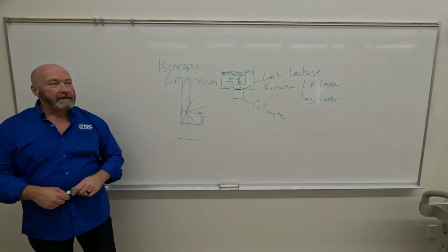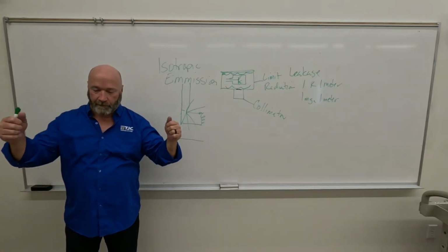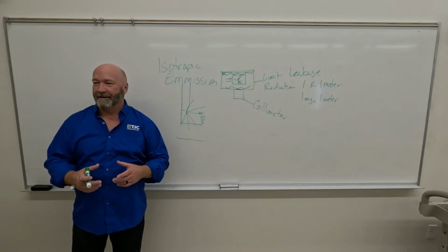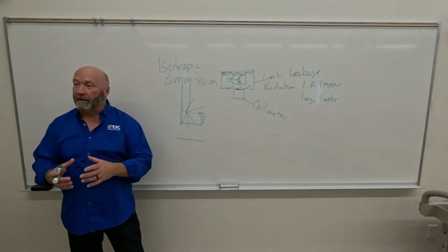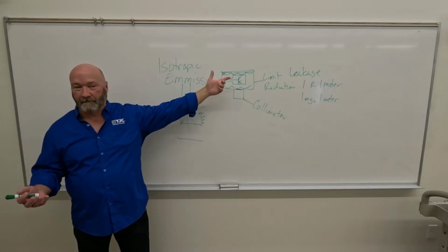What I mean by that is we're leaking oil. Okay, so you walk into an X-ray room, an X-ray tube is parked over the table. You see a puddle of oil on the table, that means this thing is leaking, most likely. Either that or somebody spilled some, right?